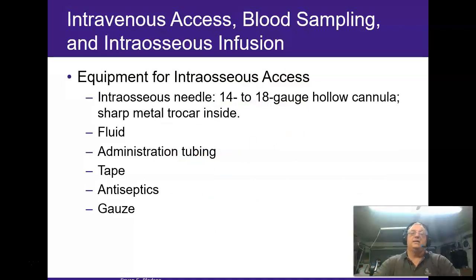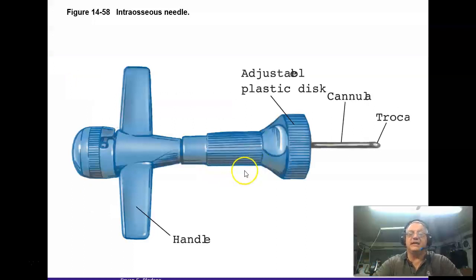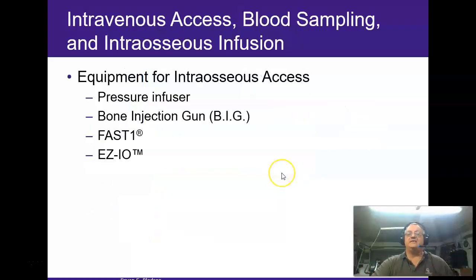And again, you're going to insert, this is the Jamshidi, a manual method of doing this. By the way, your easy IOs, you can also put those in manually, although I wouldn't recommend it. The bone gun, I have nothing nice to say about those. I am telling you right now, I'm definitely biased against those.